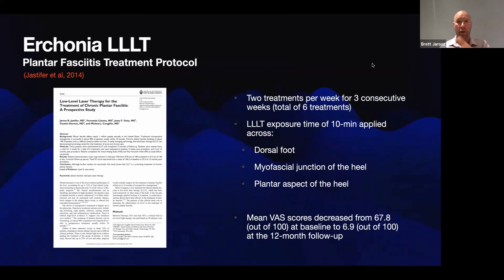All of these so far, though, are very basically sort of point and shoot, but we have seen the complexities that are involved in the neck and shoulder one, where they went brain, they went wanding through here, they went wanding through the arm and making movements. So we can see already in the literature, there's a couple of combinations here. Most of the ones I'm sharing right now, they're all just point and shoot.